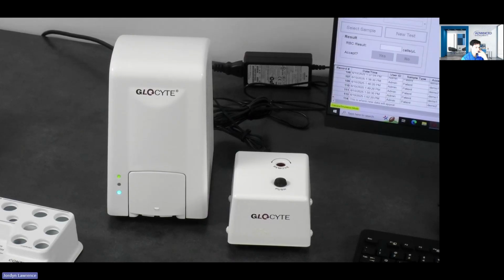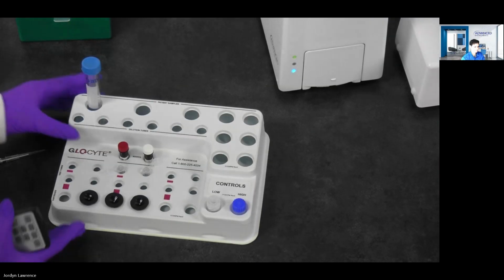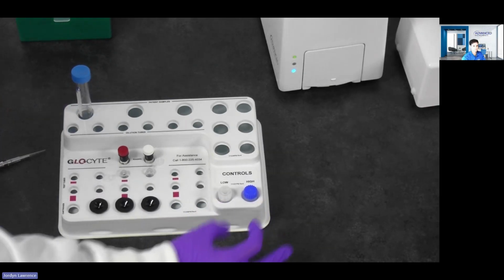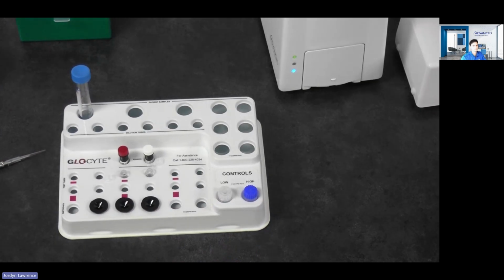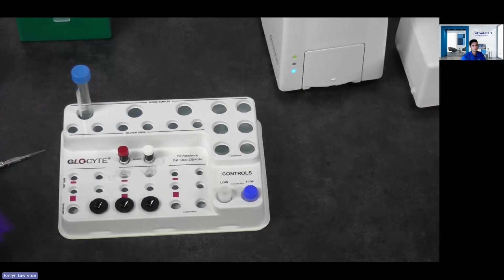I also have right next to me the sample preparation tray. So you'll see here, I have my controls over here. I have the high and the low. You're going to want to run those every 24 hours. And these want to be stored between 2 and 8 degrees Celsius. And once those are open, they have a shelf life of 30 days.